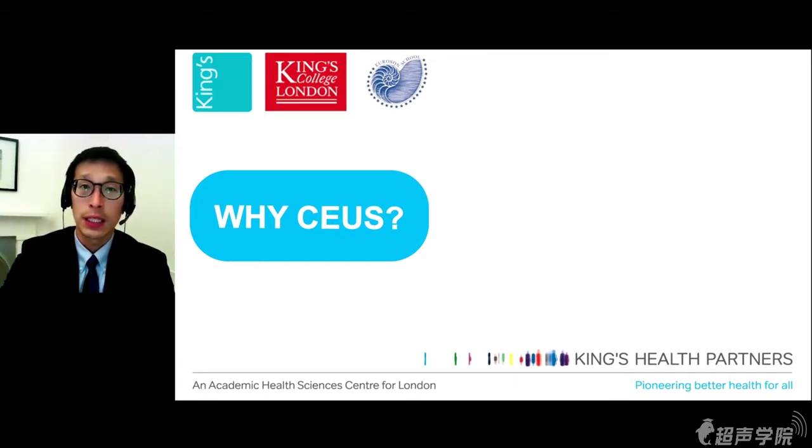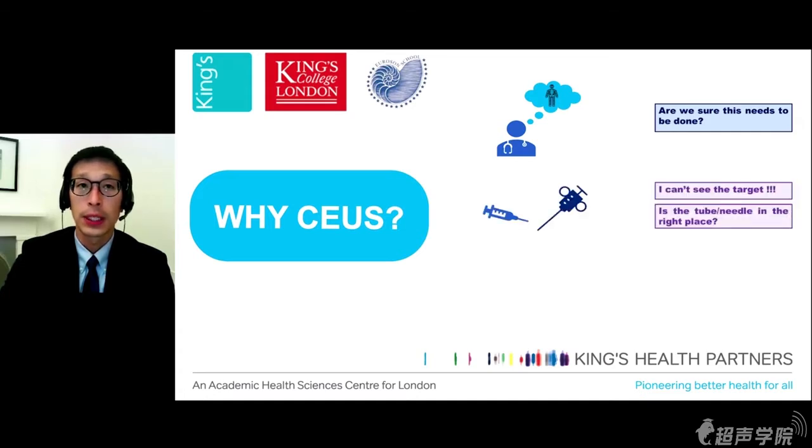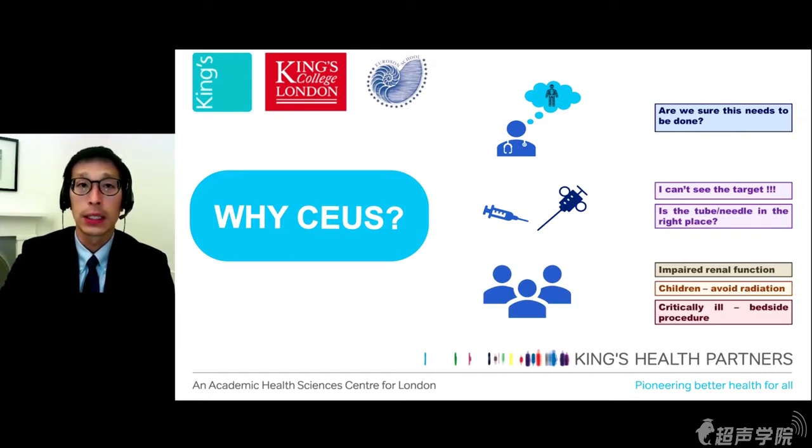I think ultrasound is good, but it's not without limitation. And the limitation may be based on its diagnostic value. It may not answer the questions that we want to ask in determining whether a procedure needs to be done. There's limitation during the procedure that we may not be able to see the target very clearly. And finally, it may have limitation with regards to the patient that we're treating. And these limitations can only be addressed with a contrast-enhanced image modality such as CT or fluoroscopy.